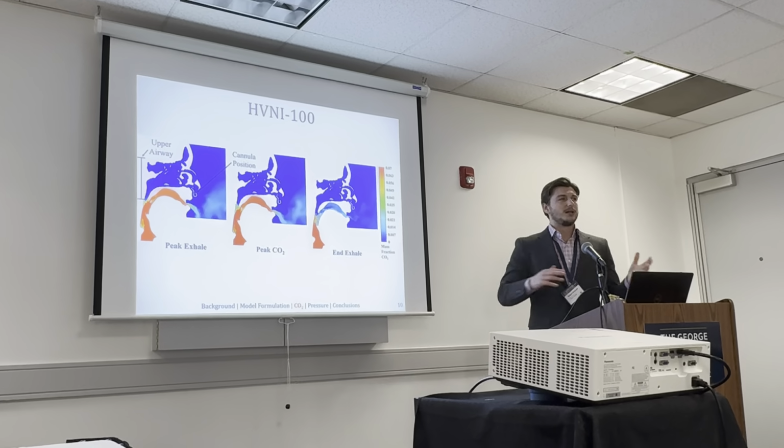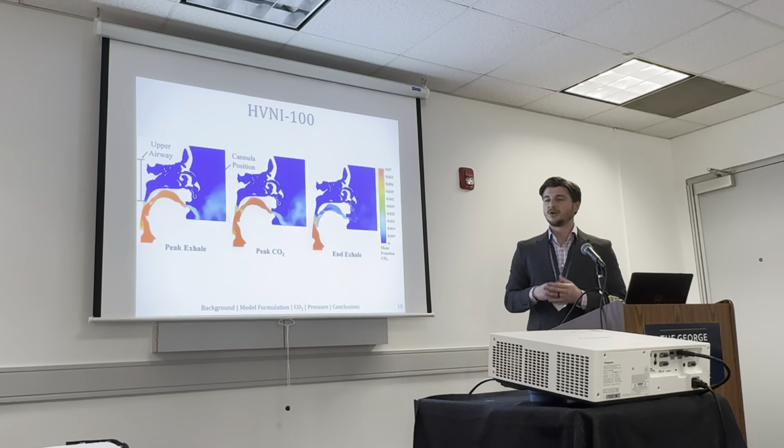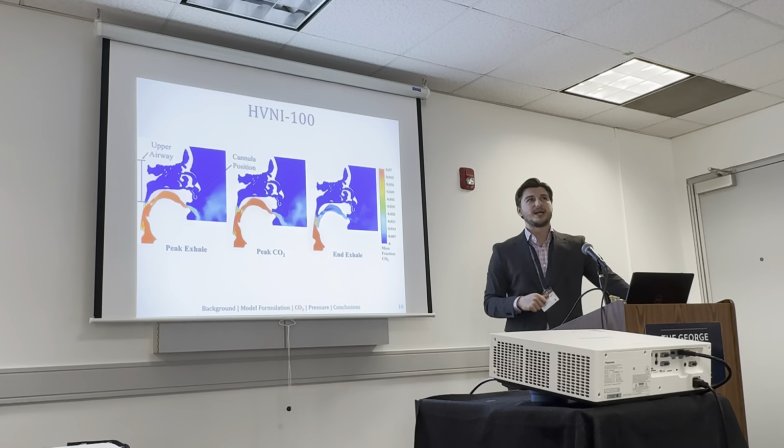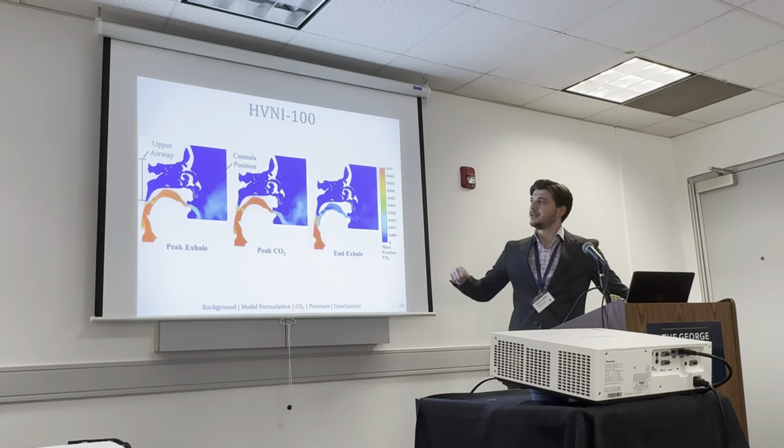Like I mentioned before, you expect that if you're receiving therapy and your mouth is completely open, you would expect a pretty significant amount of flush, and you can see that here.